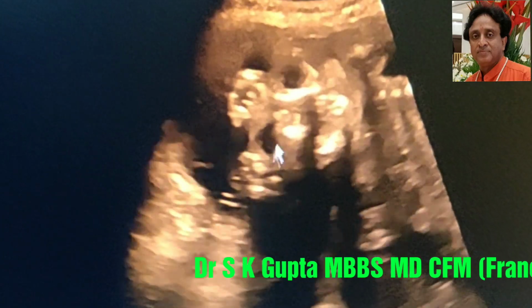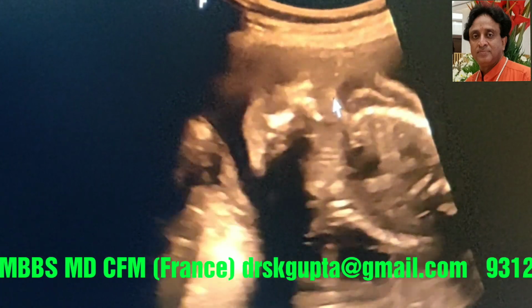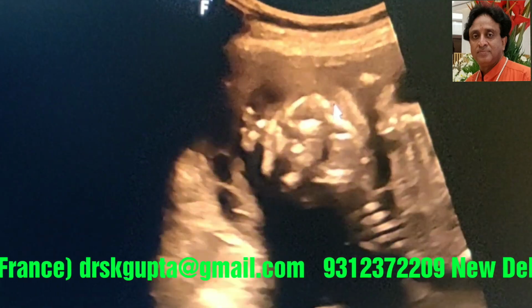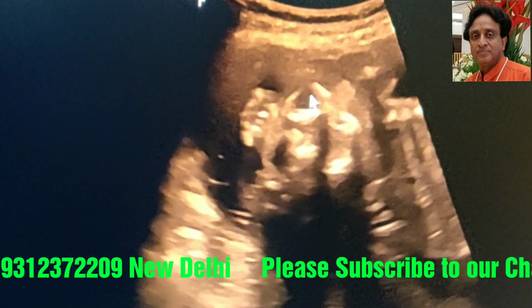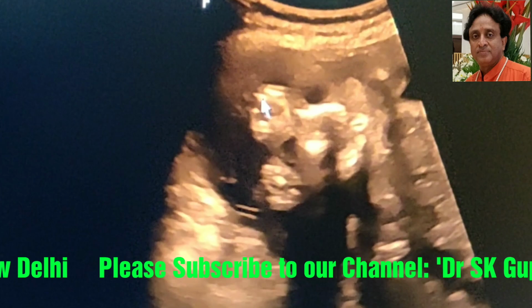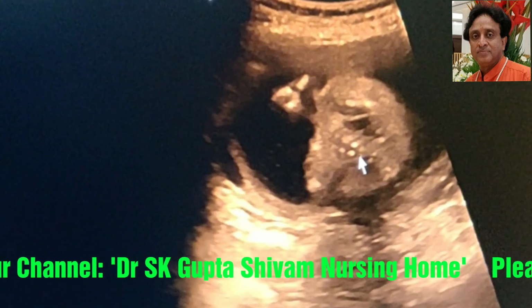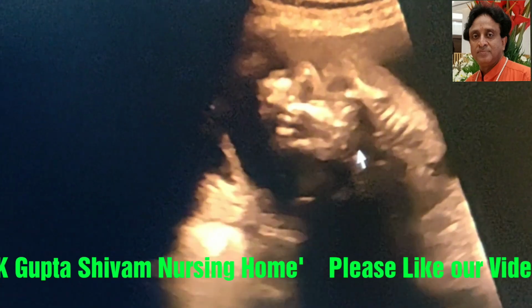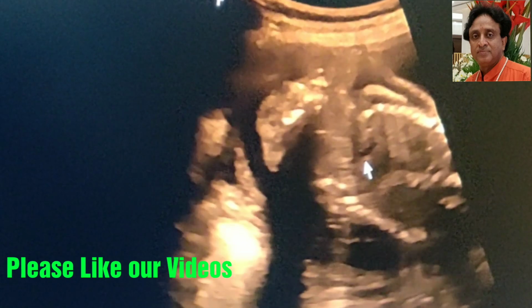You are seeing the frog-shaped eyes, and I will try to show you in slow motion. This is the fetus which is seen with the frog-shaped eyes, and this is the hand of the fetus, and this is the fetal brain that you can see. And the fetal brain is hanging, and this brain tissue, when it hangs, is called exencephaly.